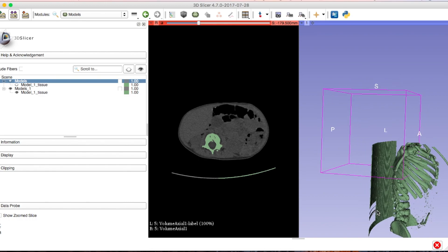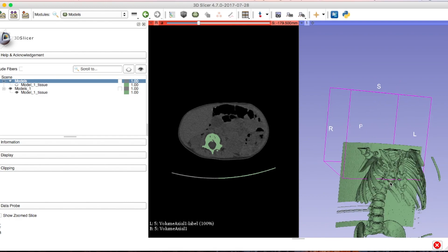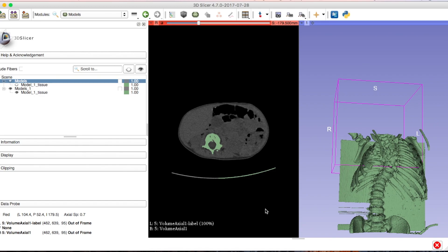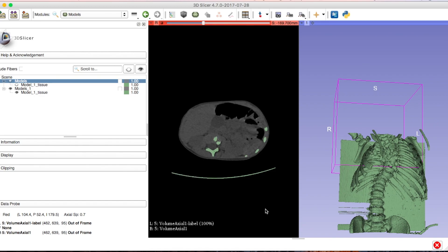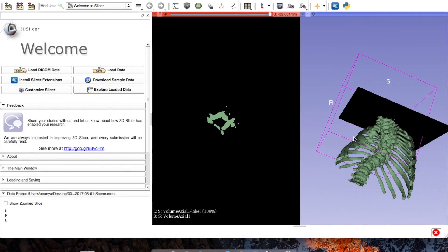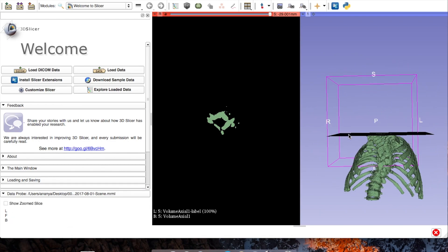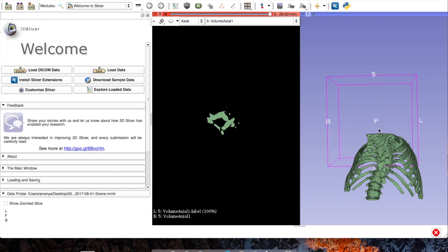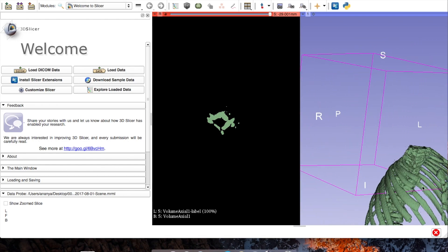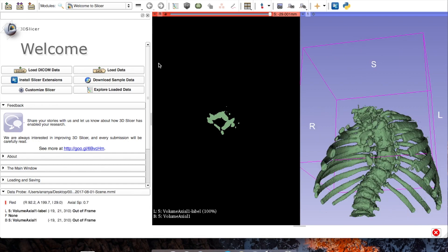I can always go back — cleaning up the scan does take a lot of time, but it's better to get it right this one time so that when you go through and do the ribs, vertebrae, and sternum you don't have to keep repeating it. Now I'll show you what a completed cleanup scan looks like. Each scan should have 12 ribs on the left side and 12 on the right, 12 thoracic vertebrae, and a sternum. However, we are dealing with pre-op scoliosis patients, so this patient only has 11 ribs on one side and some ribs are fused.